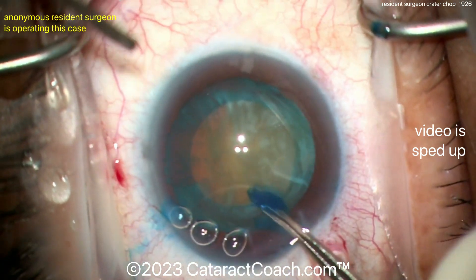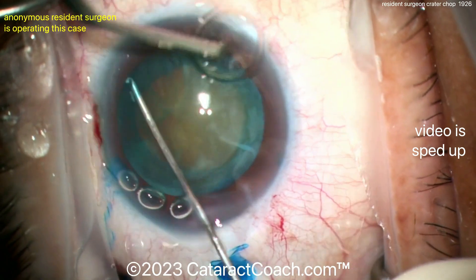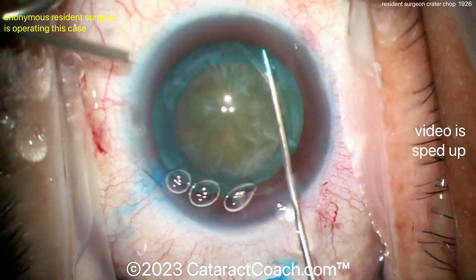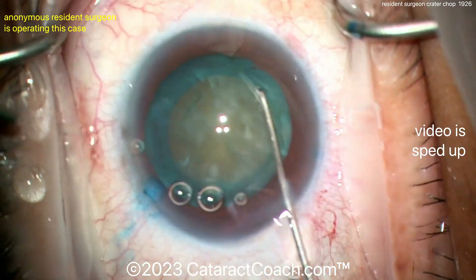No losing the viscoelastic that's in the anterior chamber — that's a beautiful looking rhexis, really nice. Here's a specialized cannula, looks like a Chang cannula, for the hydrodissection in a couple of different quadrants.